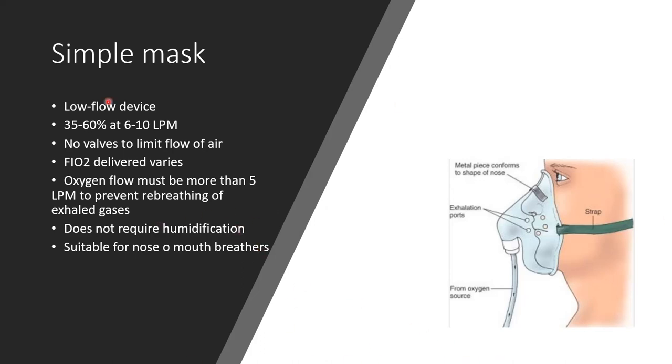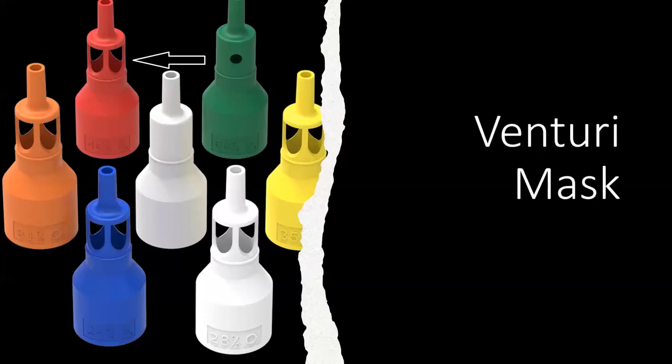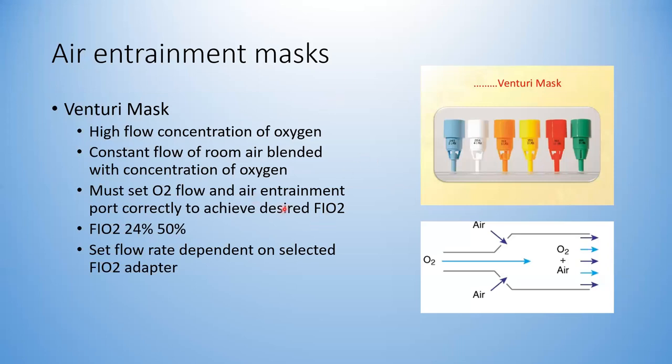All right, we're now going to proceed with the next device, and that is the Venturi mask. I'm sure that most of you have already experienced putting a patient on a Venturi mask. So what is the principle of this particular device? Well, let's go ahead and move over here. The most important principle is this one. You notice that each of these devices have openings like this.